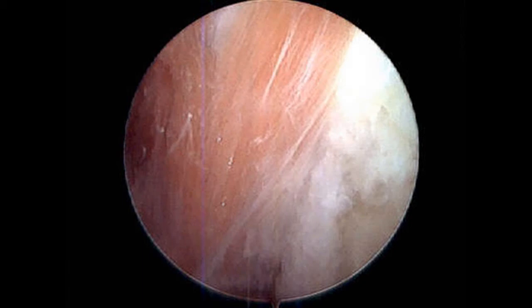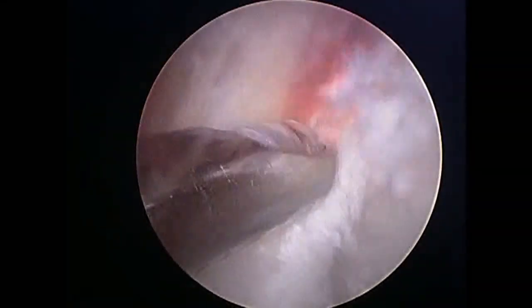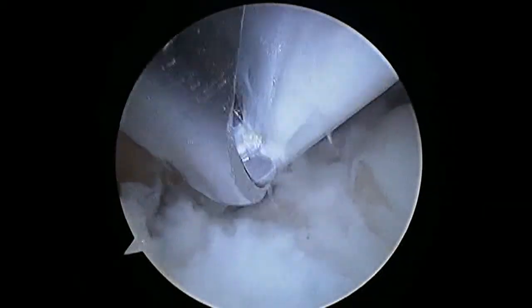Possible pathologies include a low-lying muscle belly, which may be removed, as well as tears and vinculae, as can be seen here. Again, it is important to exercise caution when debriding at this site due to the proximity of the neurovascular bundle.